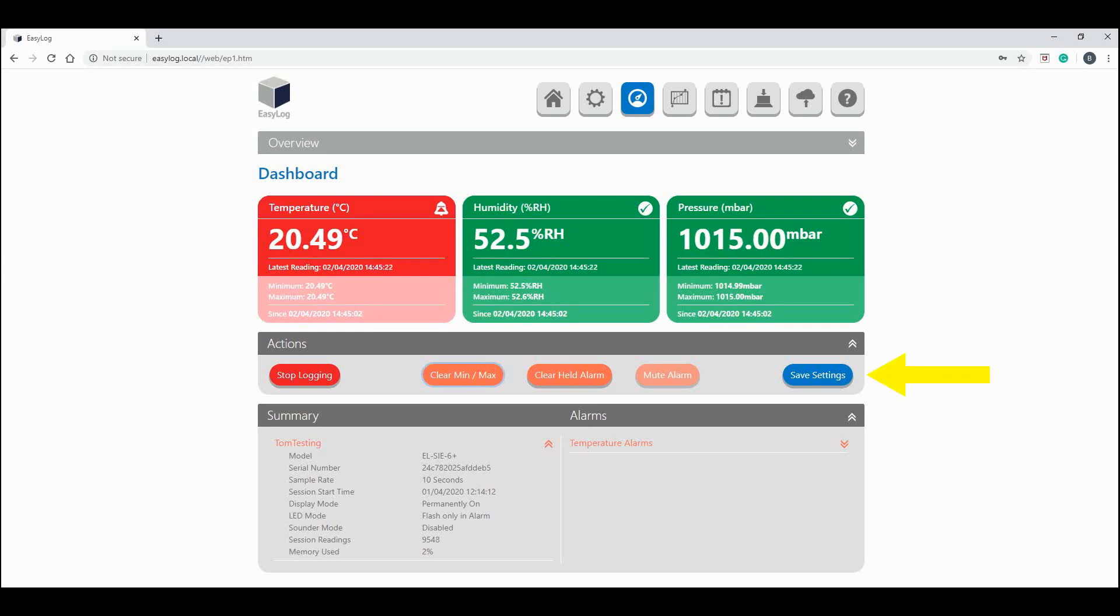The save setting option here saves your device's configuration. Once clicked, your configuration will be saved directly to your PC. To save and use in the future, you can upload the save file to the EasyLog web page when setting the configuration on your other devices.